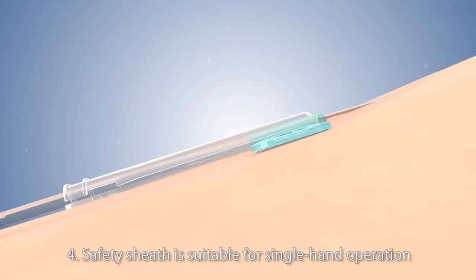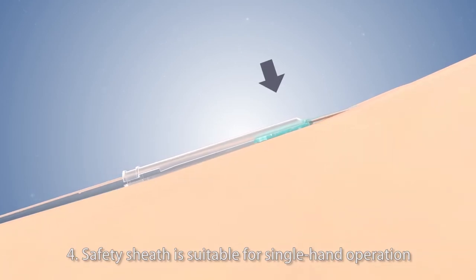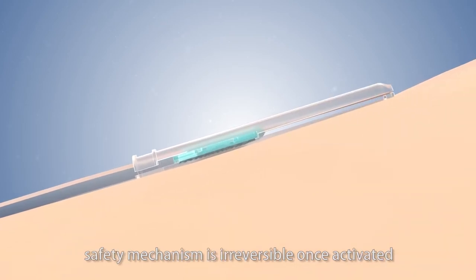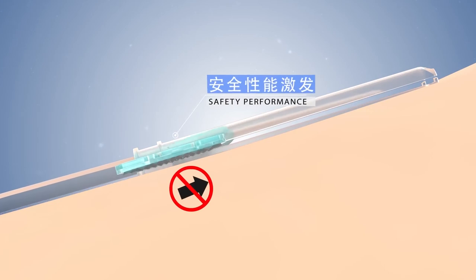4. Safety Sheath is suitable for single-hand operation. 5. Medline's latest safety sheath ensures that the safety mechanism is irreversible once activated.